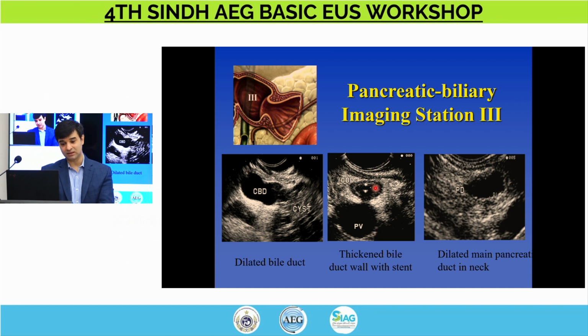I'll point out that when you do have a dilated bile duct, like in this patient, again look for what is behind the bile duct, and that is going to be key to preventing inadvertent sticks of the bile duct. So many a times when you move on to therapeutic maneuvers, your trajectory of entry is going to be from here.